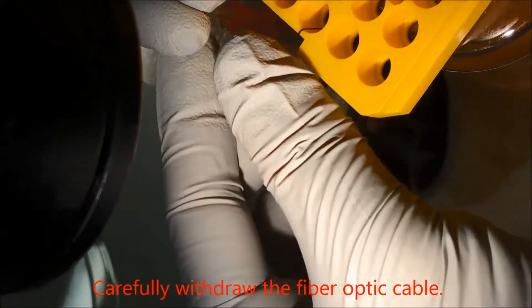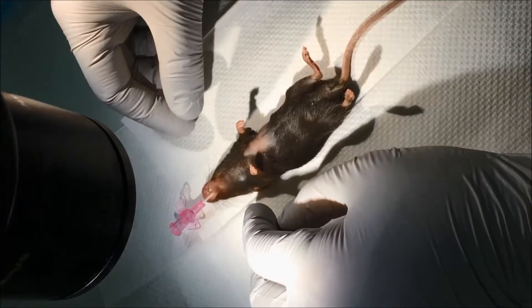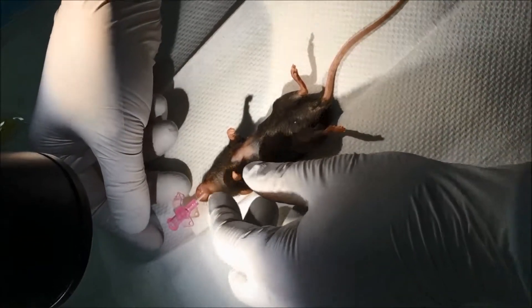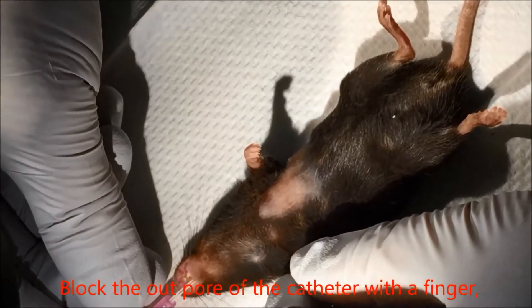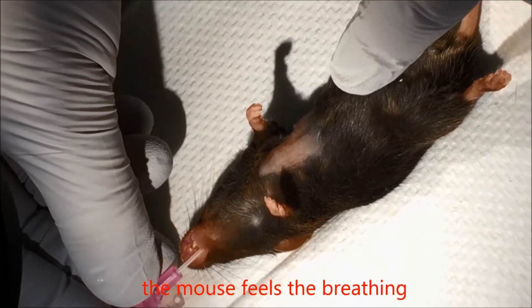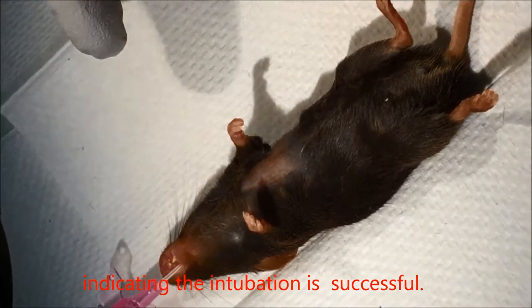Carefully withdraw the fiber optic cable and lay the mouse down. Block the outlet of the catheter with a finger — the mouse shows obvious breathing difficulty. Move the finger away and the mouse breathes much more comfortably, indicating the intubation is successful.